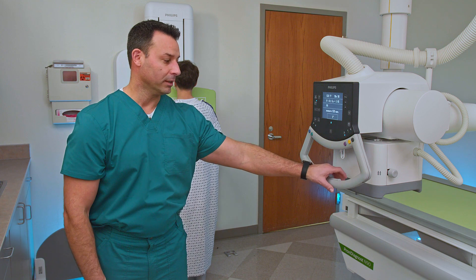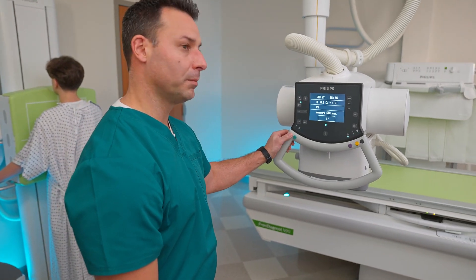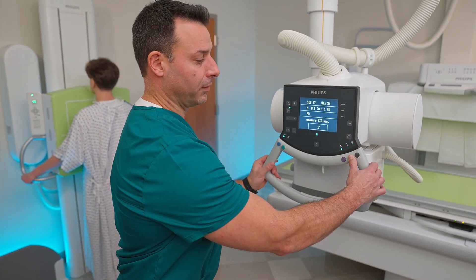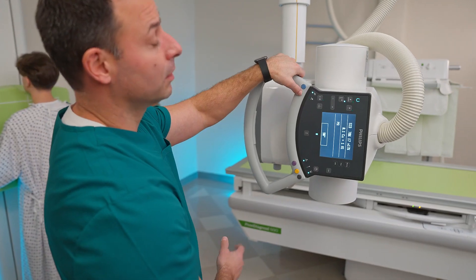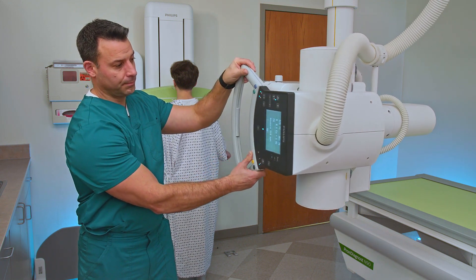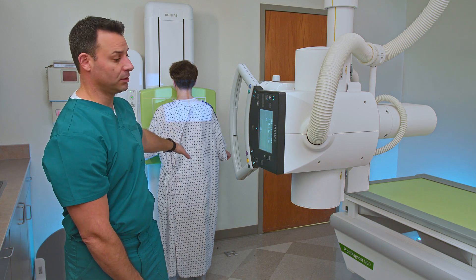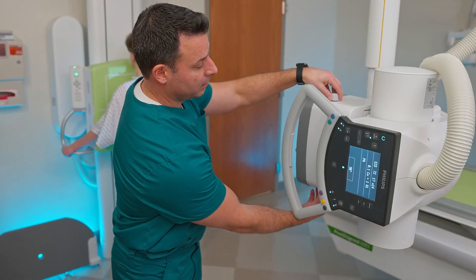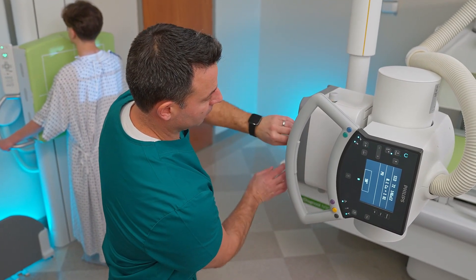This is our Aleva overhead tube. You can easily grab the handle and move the tube anywhere in the room, but we also have color-coded buttons on the tube. The blue button is for the transverse detent — once you're in a detent, you get a green indicator light. Yellow is for height adjustment, black is for angulation, the green button is for longitudinal detents, and purple lets you rotate your tube. We have a collimator light that's very bright so you can easily see it on the patient. With the technologist in mind, the collimators are on the side of the collimator box so they can easily grab and manually collimate from the side — it's no longer in the front of the box.